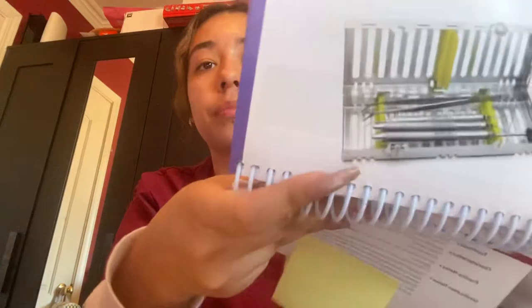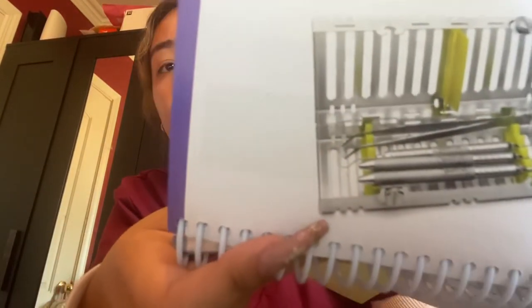Then we're going to put our instruments into a basket or a cassette — it should look like this. We're going to place the basket into the ultrasonic cleaner, close the lid, and this should take about five to fifteen minutes to complete.